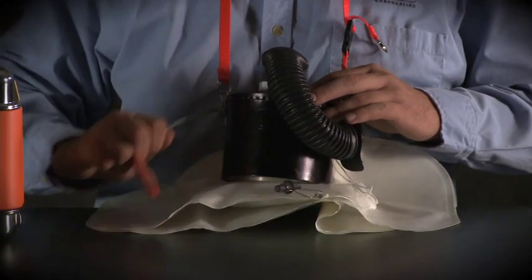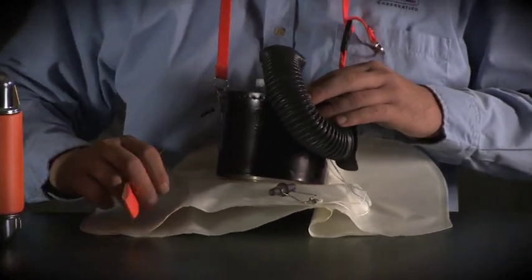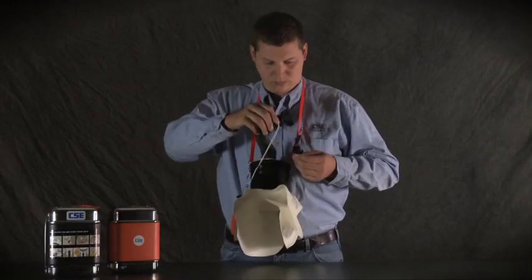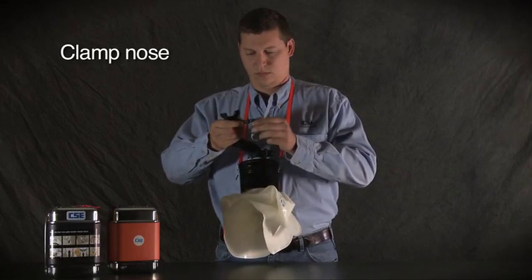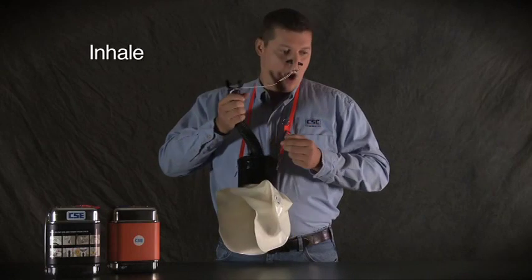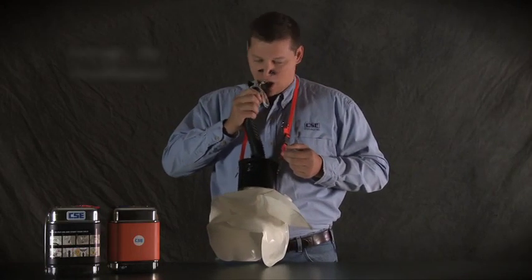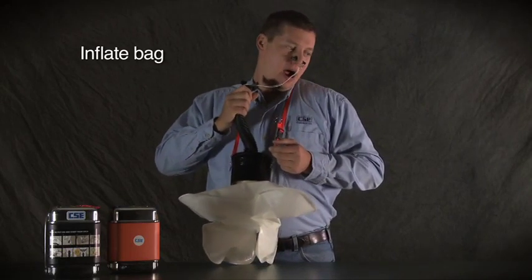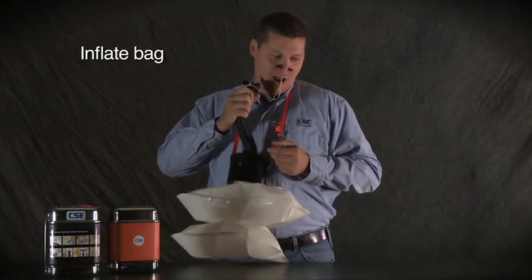Pull the starter tag as you would on your SCSR. Your breathing bag will not inflate, so you will have to do a manual start. First, grab the nose clamp attached to the mouthpiece and clamp your nose shut. Then, with the mouthpiece out of your mouth, inhale a deep breath. Put the mouthpiece in your mouth and exhale into it — blow hard enough to push air down into the breathing bag. Repeat the cycle until the breathing bag is full; it should take only three to six breaths.